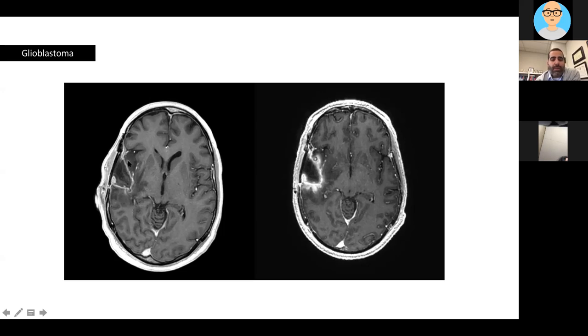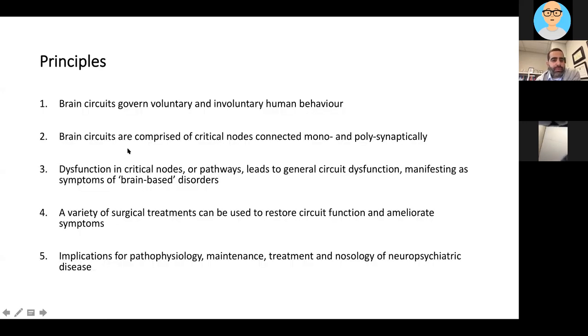So this is, for example, a patient with a right-sided temporal resected, so operated on, brain tumor, leaving behind this resected rim. And we're opening up the blood-brain barrier along that resected rim, because when this tumor comes back, 98% of the time it comes back within a centimeter of what you resected. So we want to enhance the delivery of chemotherapy to that part of the brain.